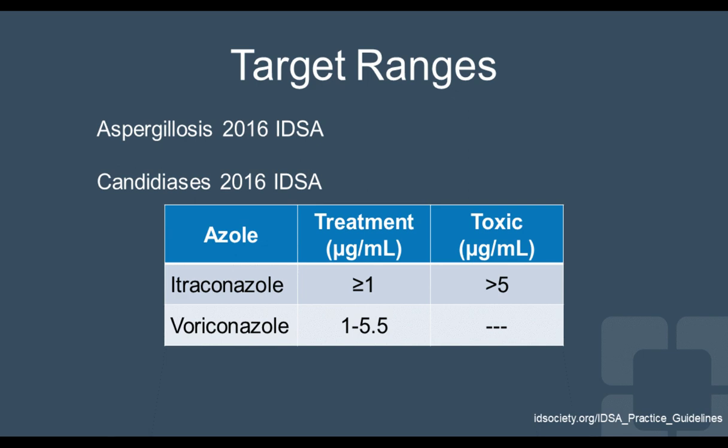The reference intervals. So obviously a normal reference interval, as you think of with calcium, for example, you couldn't take 120 healthy individuals and run isavuconazole because healthy individuals wouldn't be on an antifungal medication. So here we can look at what are therapeutic or prophylactic levels in literature from large trial studies or from societies such as the Infectious Disease Society of America shown here, where you can establish proper ranges for your method.